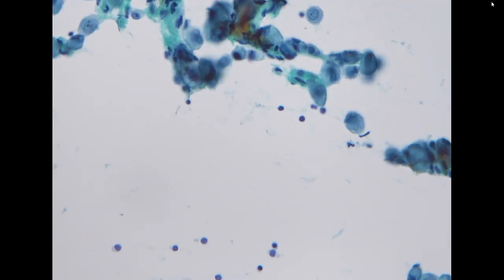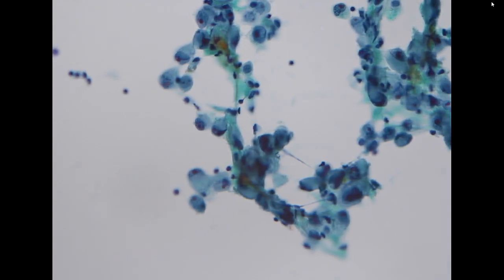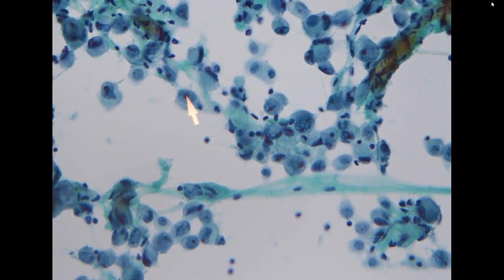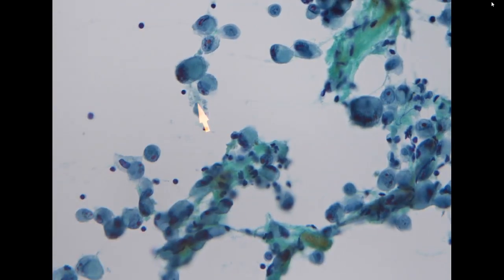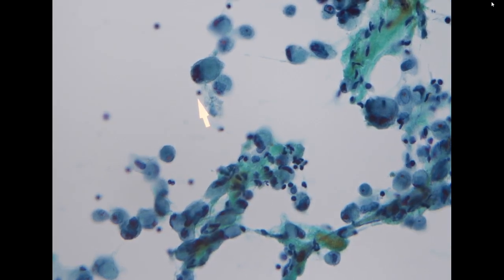So in this specimen, we know it is positive for adenocarcinoma, and the lesional cells, the tumor cells, compose most of the cells that we see here. And we can definitely appreciate marked nuclear atypia with vesicular chromatin, very prominent nucleoli, and most of the cells have this eccentric pattern. So it is adenocarcinoma, and because the past history is not gastric, it is pancreatic cancer. So I think it is still okay that it is compatible with pancreatic adenocarcinoma, but it is not very common to see this morphology in pancreas cancer.